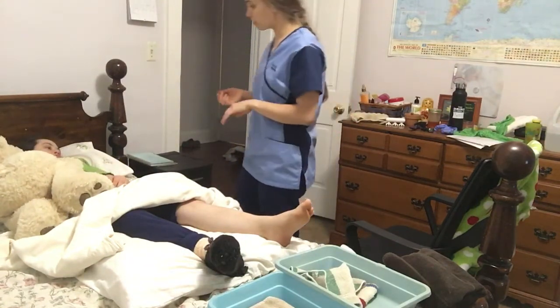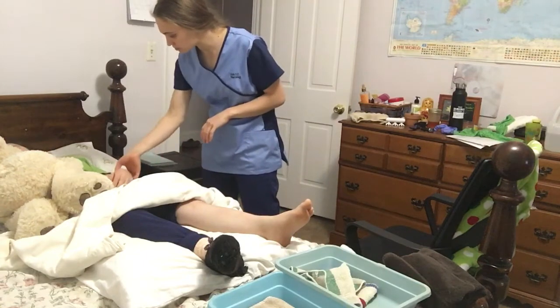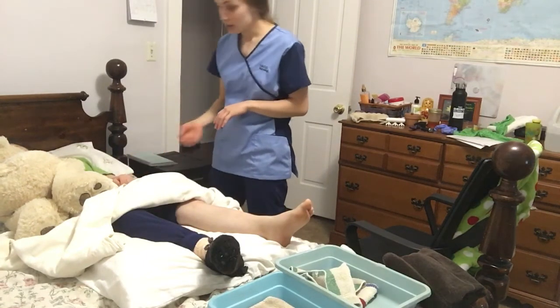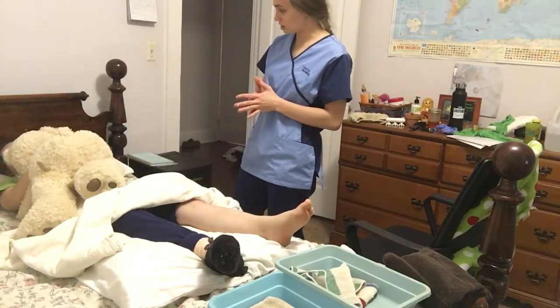I'm washing my hands. Could you please tell me your name and date of birth? Thank you. So today I'm going to be helping you apply TED stockings.